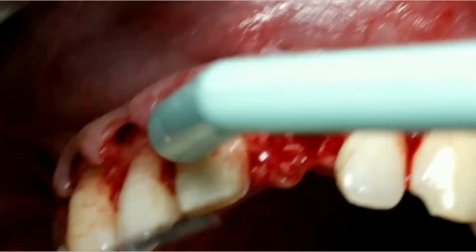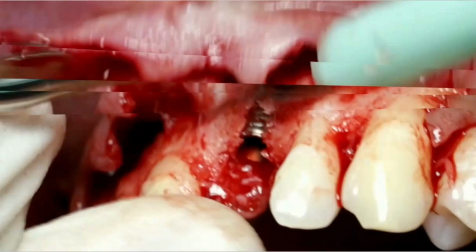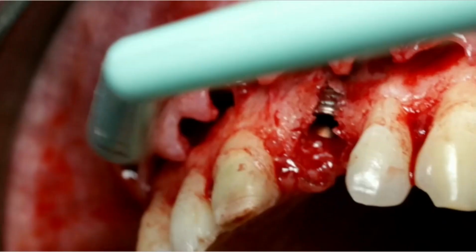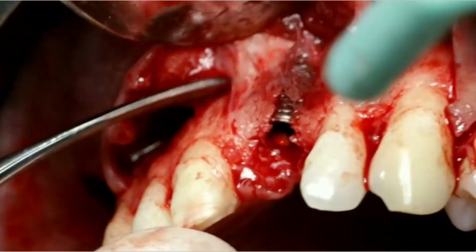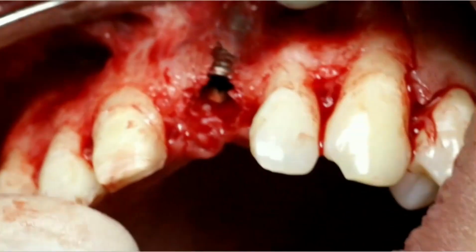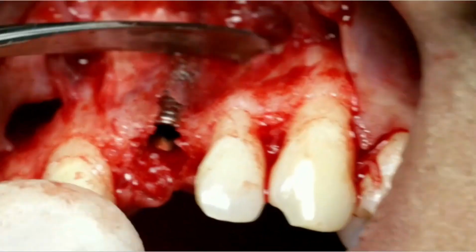During the planning, we noticed, and after the implant insertion, we noticed dehiscence in the labial bone. Look at the reality, the same. So the amount of dehiscence in the labial plate of bone was expected before, and look how the implant gained high primary stability even in a very challenging case.